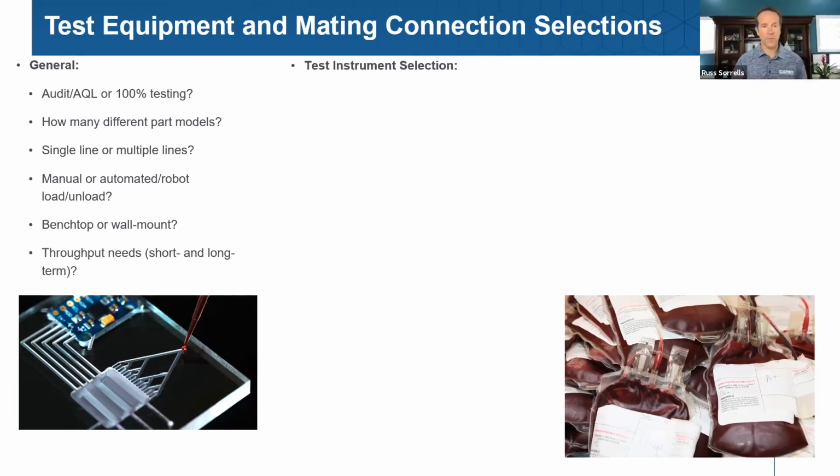Yeah, and that's going to determine the cycle time. So do you need it in 10 seconds? Do you need it in 4 seconds? Do you need it in 20 seconds, a minute? So that's the throughput needs critical to identifying the quantity as well as applying the appropriate instrumentation, which you're going to talk about now, I think.